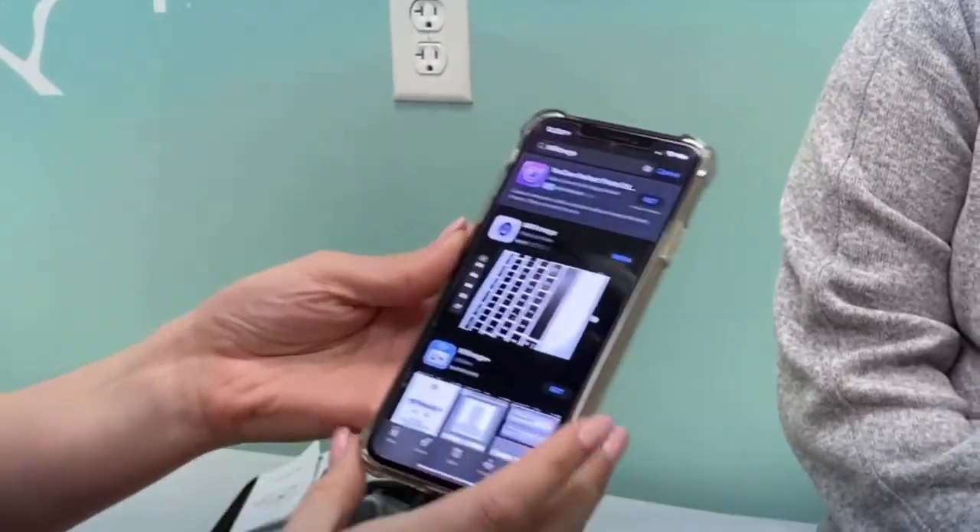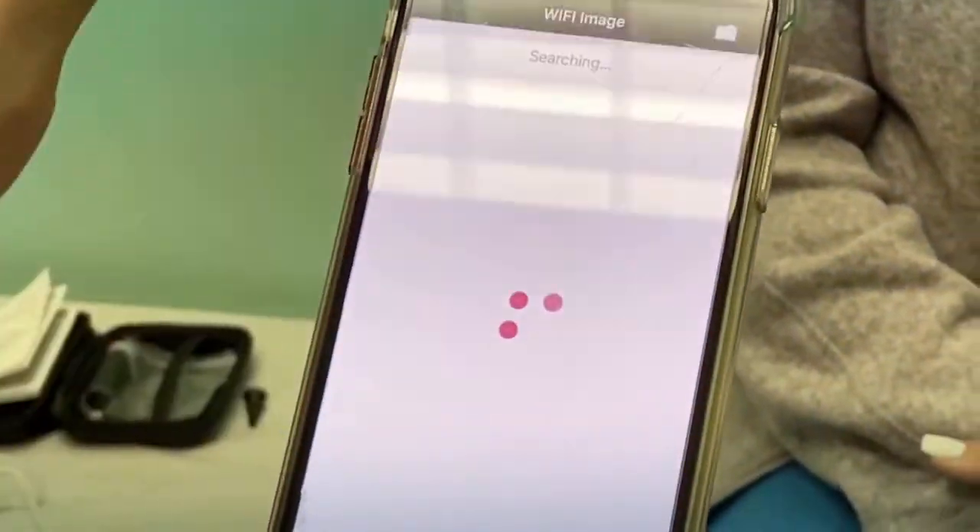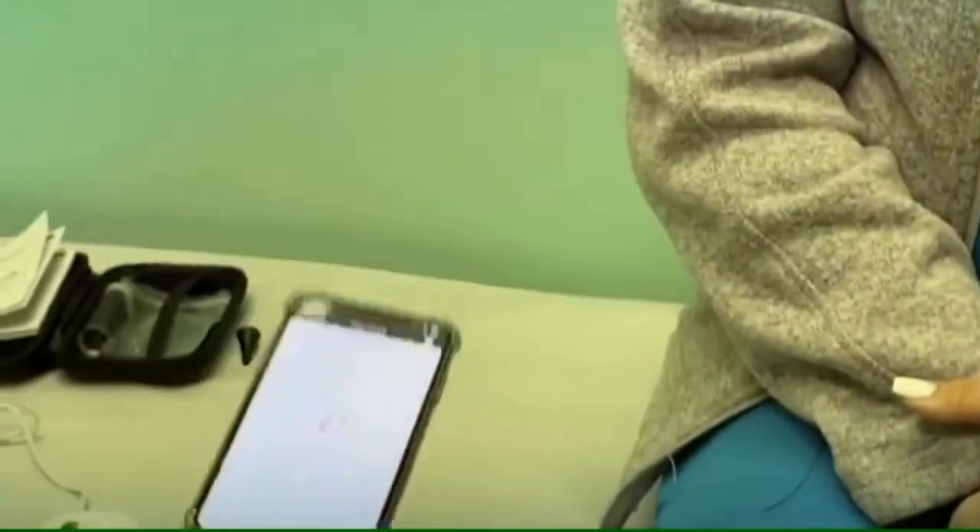So let's see, app store — I already got it pulled up. This is what the app looks like. I already have it downloaded so I'm going to go ahead and open it. It'll pull up to this page.